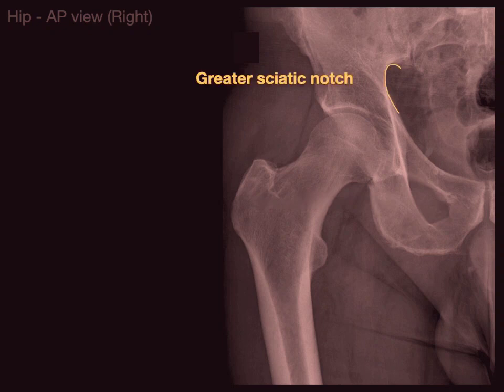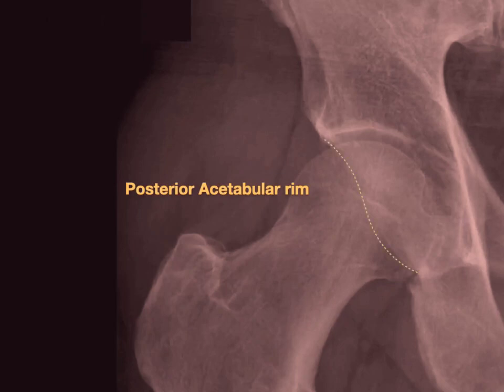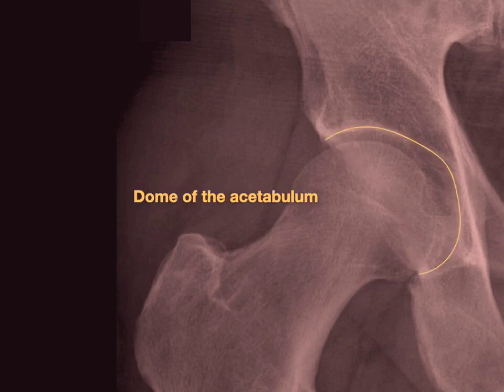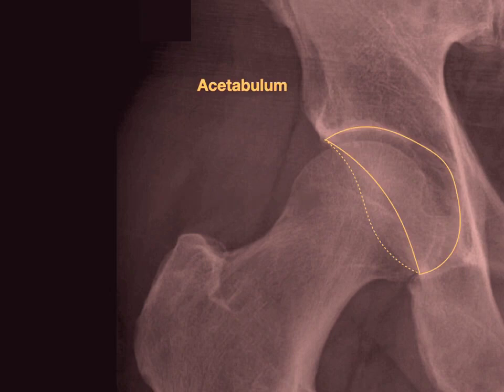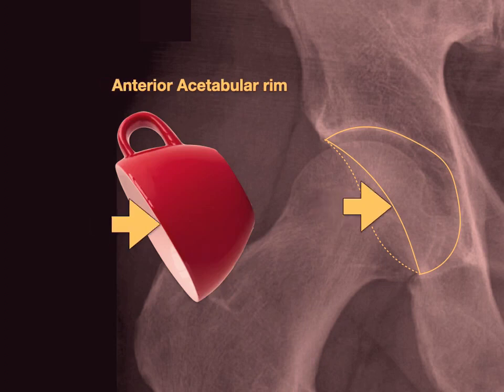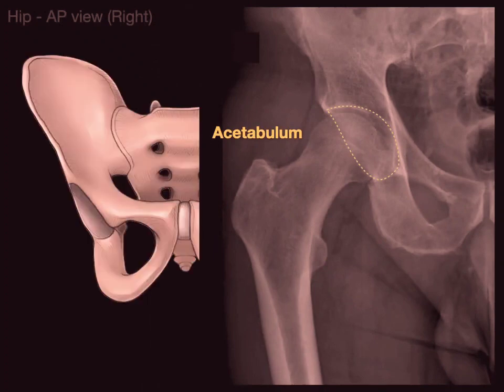This structure right there is showing the greater sciatic notch, and this structure is showing the acetabulum. The acetabulum has three parts: the posterior acetabular rim on the back, the anterior acetabular rim, and the dome of the acetabulum. So there are three structures making up the acetabulum — it kind of looks like a cup — and that is the socket of the ball-and-socket joint of the hip.